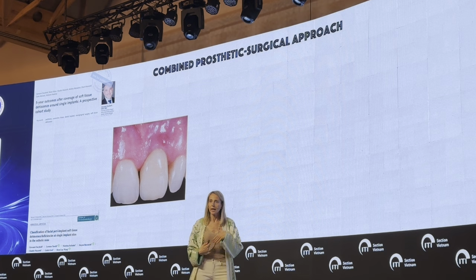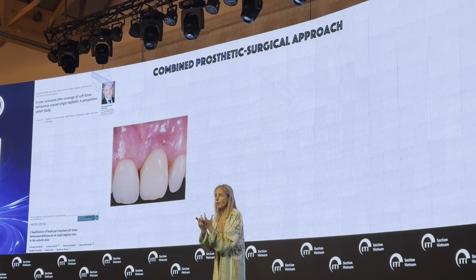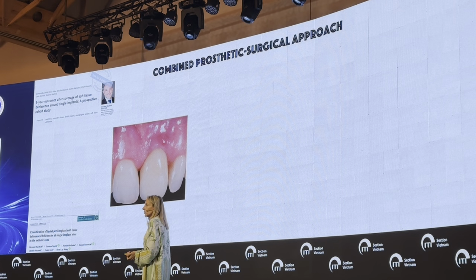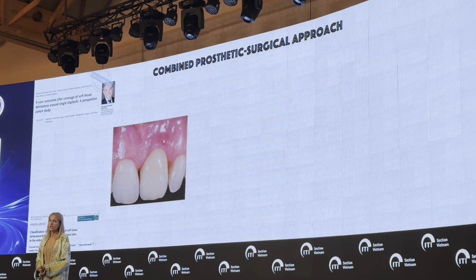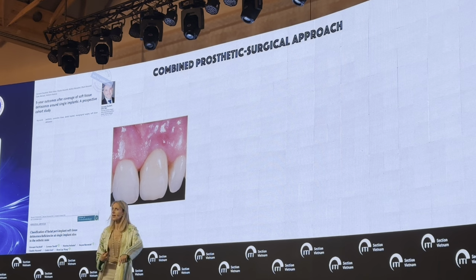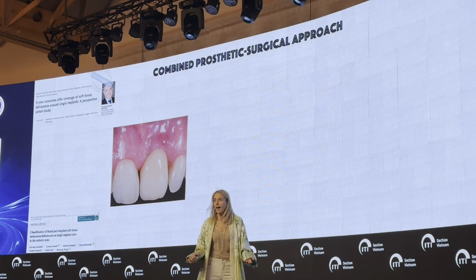And when the patient came back a week after, I looked, and the interproximal soft tissue was much better than 1 week ago. So I called the professor and said, look how the soft tissue improved. So he asked the patient, can you please keep staying with this short, horrible provisional crown for 1 week? And the patient said, okay, I will.